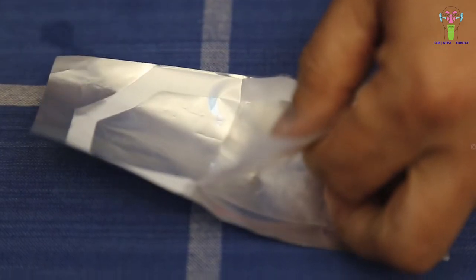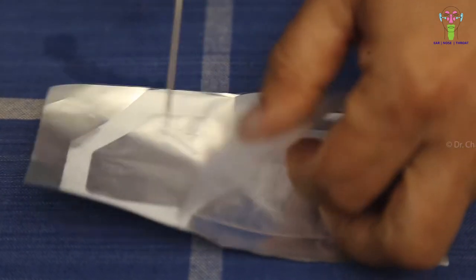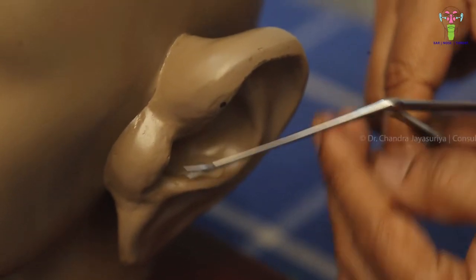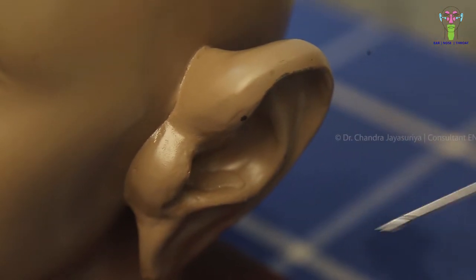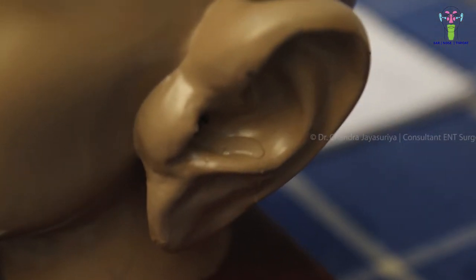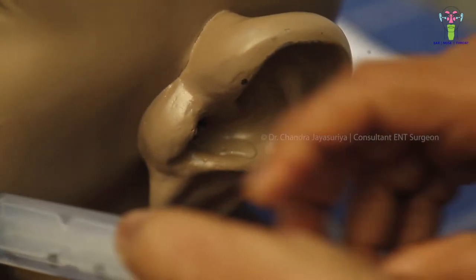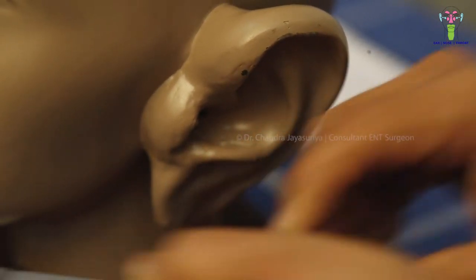You can see it is so small we can easily insert it into the ear canal like this. And then we can see how it enlarges with water. It absorbs water after some time because when we put the ear drops, this enlarges and it will fill the ear canal.